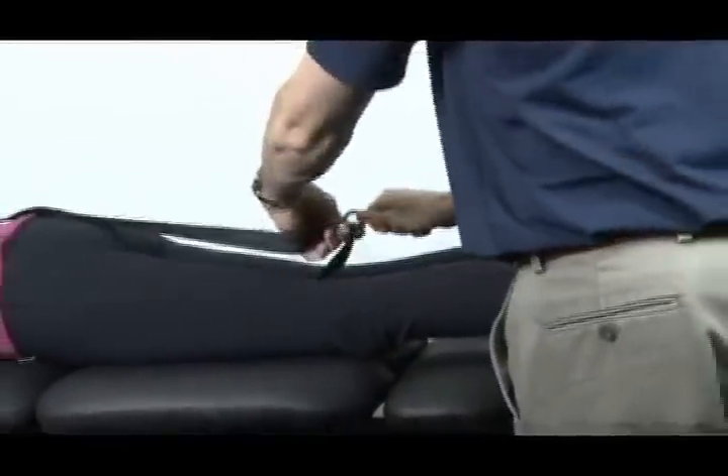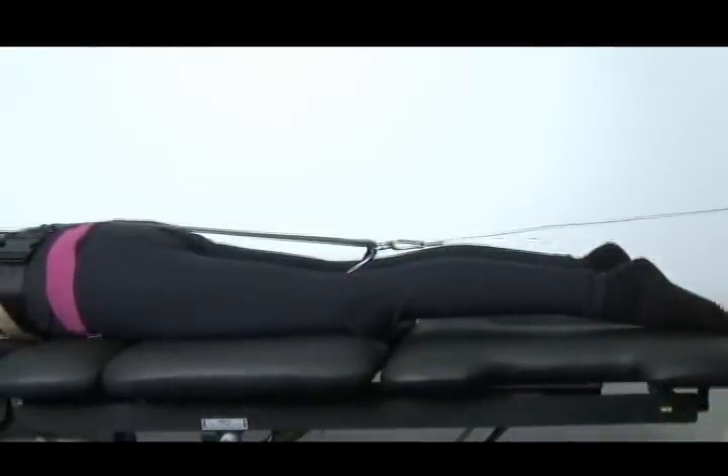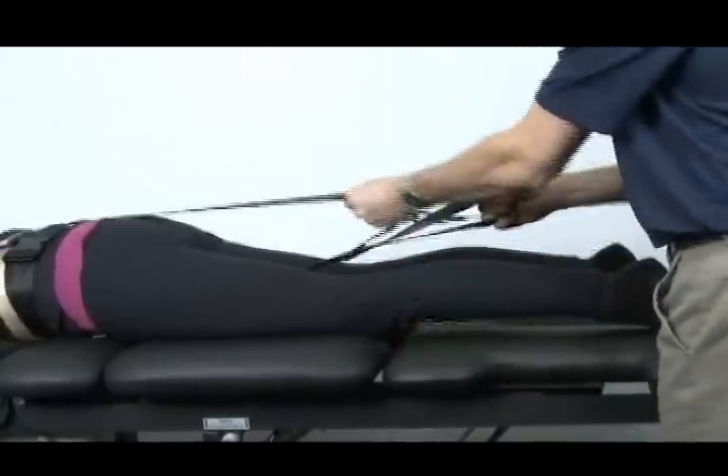Connect the cable from the decompression head via the D-ring to the round ring on the belt. The final step is to grasp the pre-tensioning loop and firmly seat the belt, which will minimize belt slippage once the treatment begins.